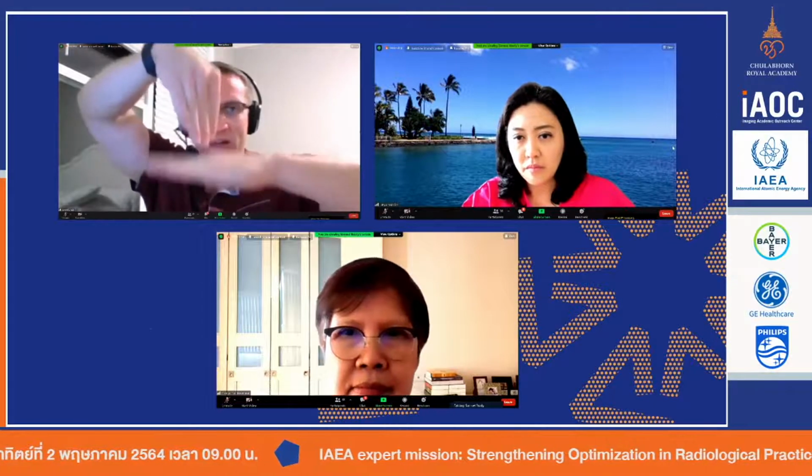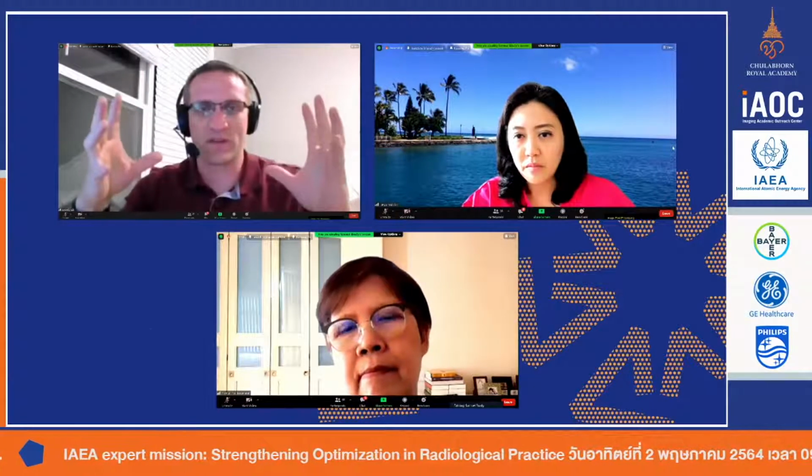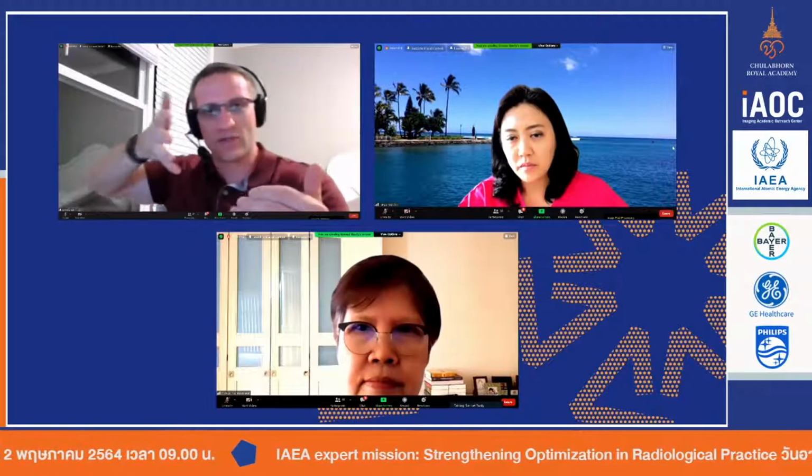And that's also the same for mobile imaging. I know it's a lot easier to not worry about a grid because when you're in a fixed room and you slide the detector and the grid into the table, the system has already got it so that the radiation is lined up perpendicular. So when you change your angles, the system is smart enough to figure that out. But a mobile unit's not. And so if you take a detector and you put a grid on it, and you slide it behind someone's back and they're sitting at a kind of weird angle and you don't compensate with the x-ray tube, then you can have potential for grid cutoff.